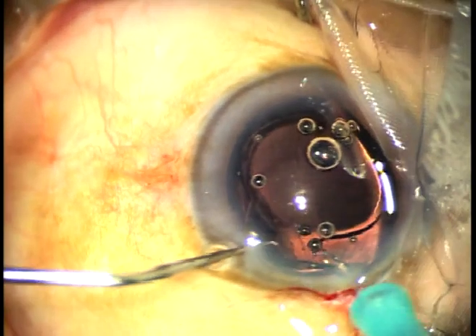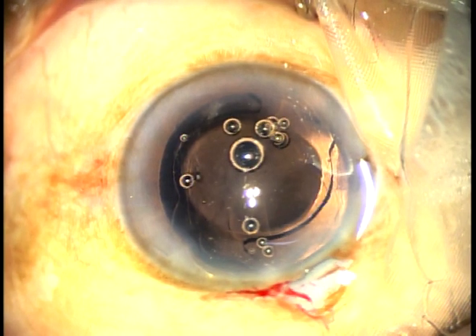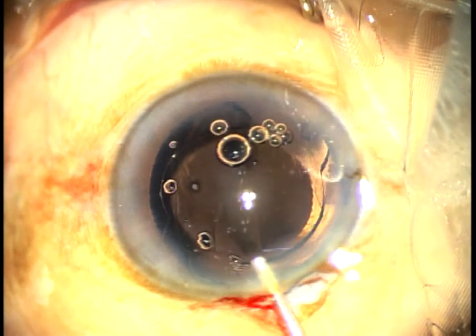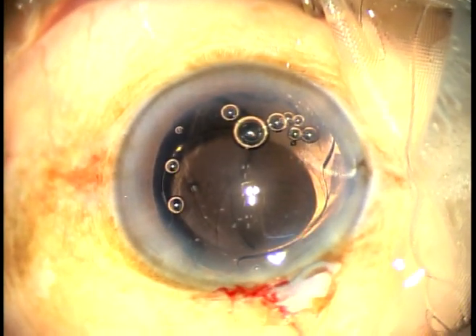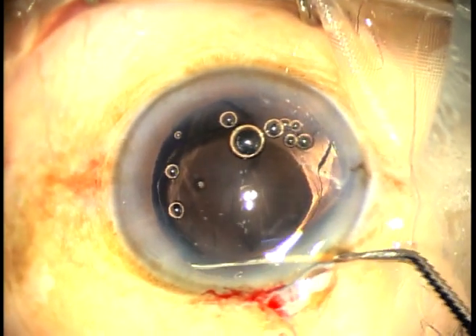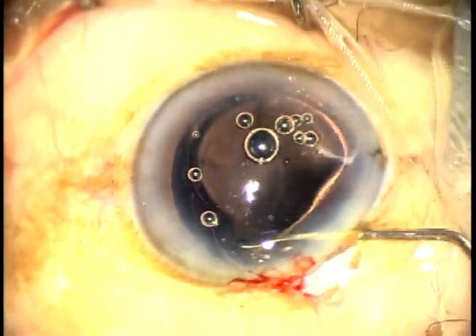And see what he did. He placed the IOL here, injected some visco, and then took the Sinskey hook. See how he is trying to push the lens to the back.